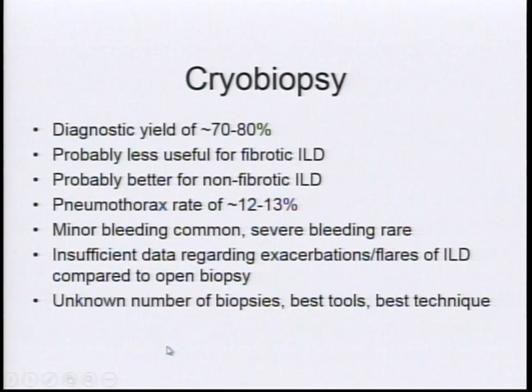And there's a lot of heterogeneity amongst different groups on the techniques that they use, how many biopsies they do, and how they control bleeding. So that's a little variable. So this is something that I would like to bring to UC in the next maybe year or so.